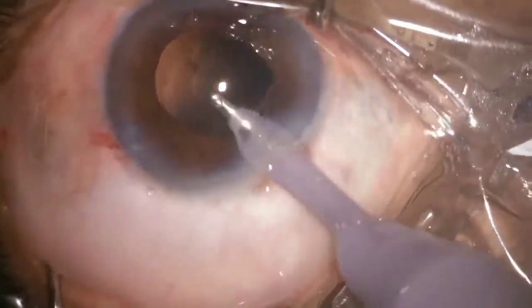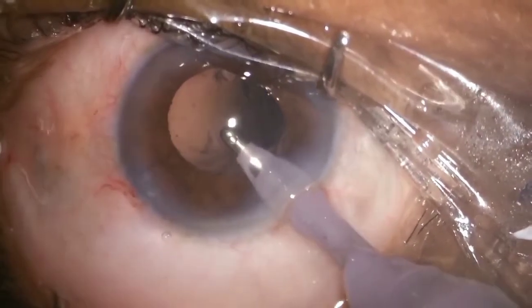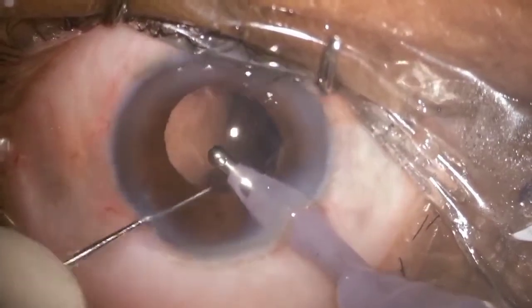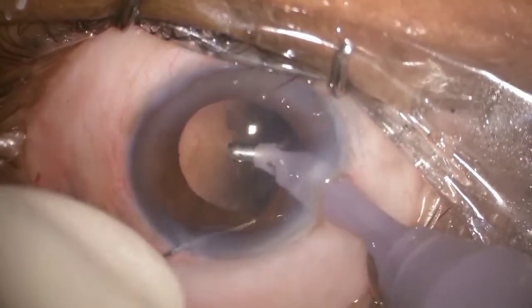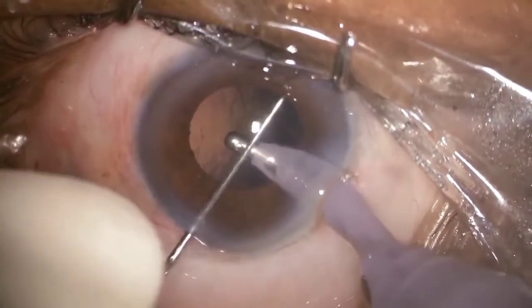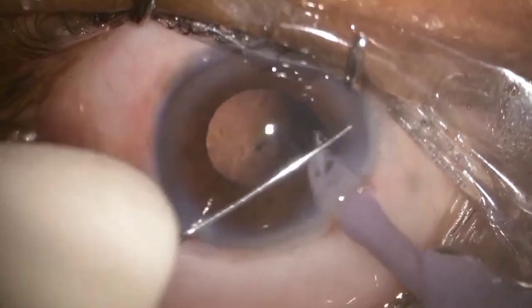So I inserted the coaxial I/A probe, and since the pupil was small, I was feeling difficulty doing the cortical aspiration. So what I did, I took again the dialer, and I was retracting the iris to see any cortex in there. Cortical matter I noticed in the superior part, and a few were noticed in the nasal part.